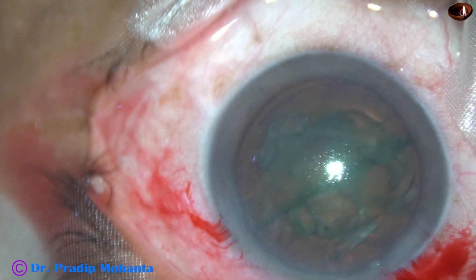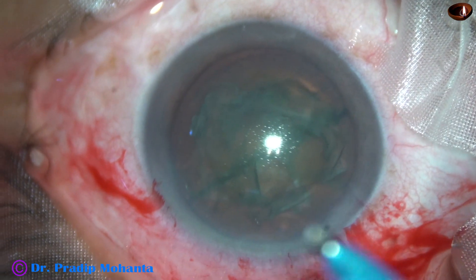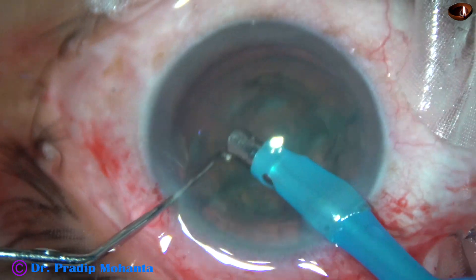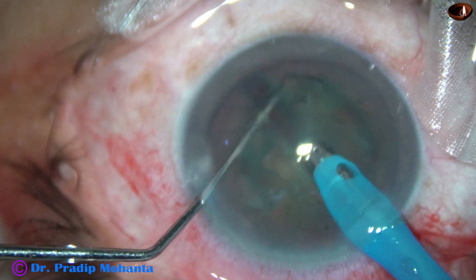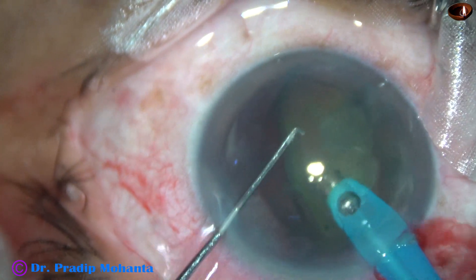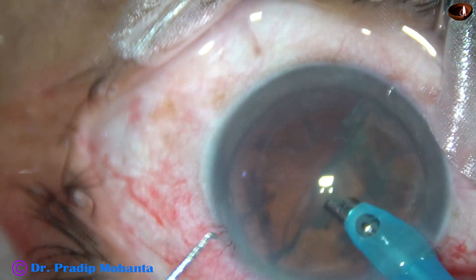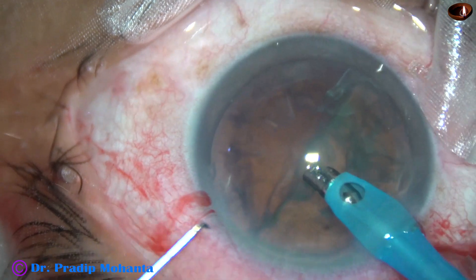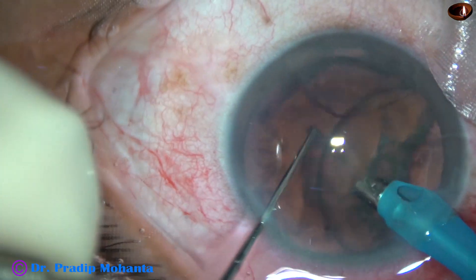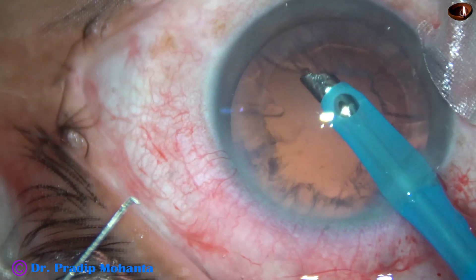Some more visco is added. The lens has been divided into two halves — two heminuclei. The tip of the FACO needle goes in; this is a 2.8 mm tip. Some superficial cortical lens matter is removed. Once the nucleus is divided into two halves and the halves are not further divided, see how easily one half floats and you can emulsify the heminucleus. It happens in soft cataracts. In hard cataracts, we have to divide the heminucleus into smaller pieces. And this is the other heminucleus — emulsified and removed in no time.